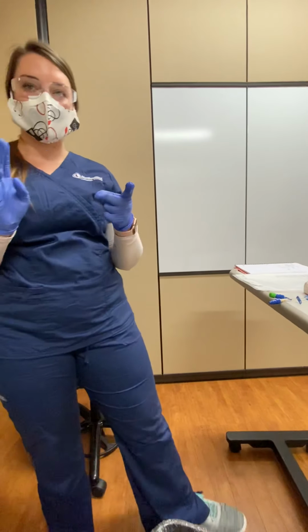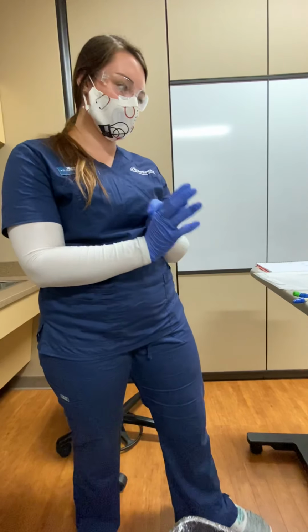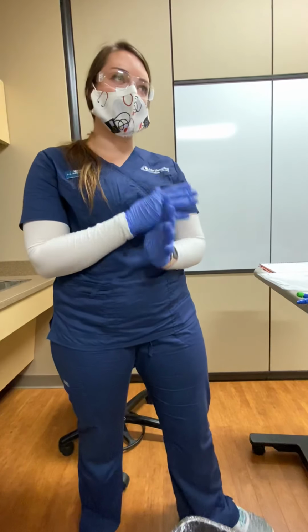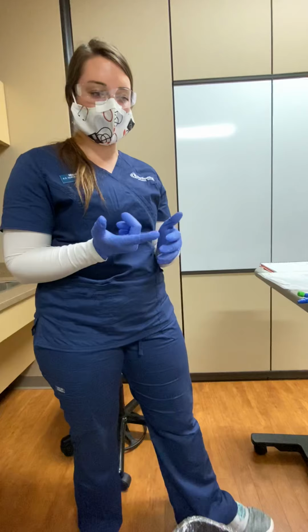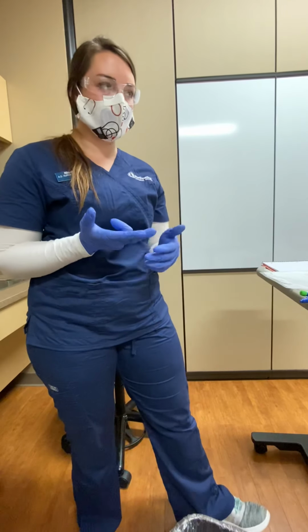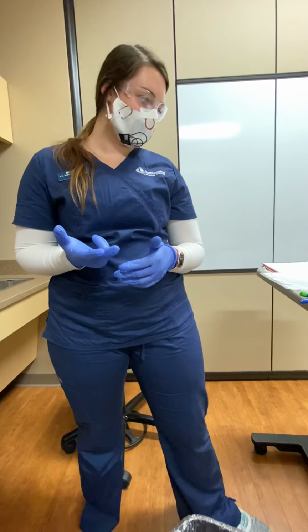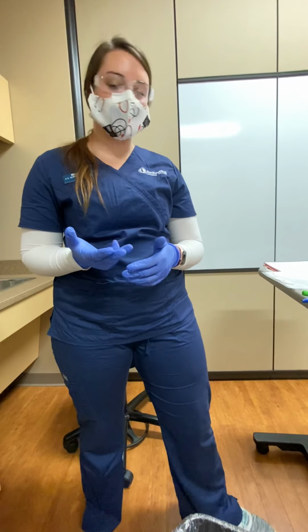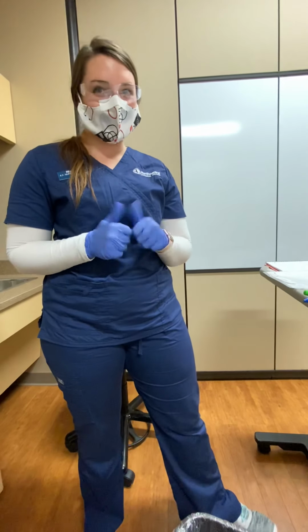I would document the date and time that I administered the Zofran through her central line, the amount of Zofran, the amount of normal saline that I administered for the flushes, how she tolerated the medication, and any reactions that happened, but she didn't have any reactions, so she's good on that.